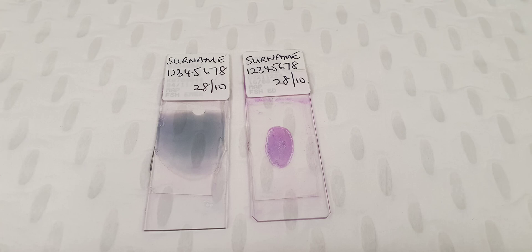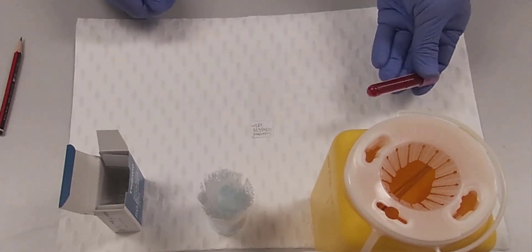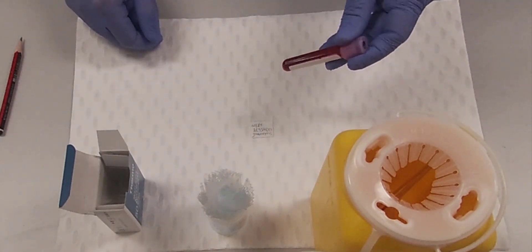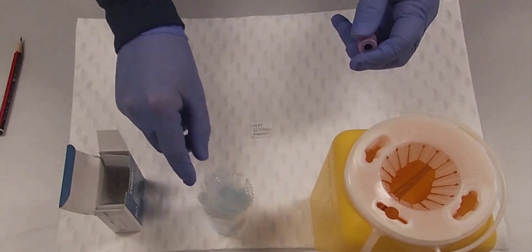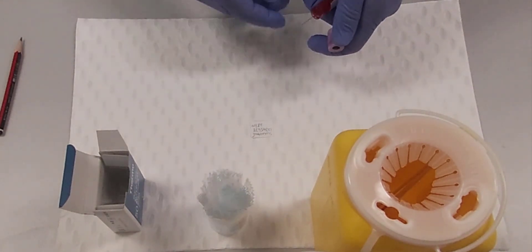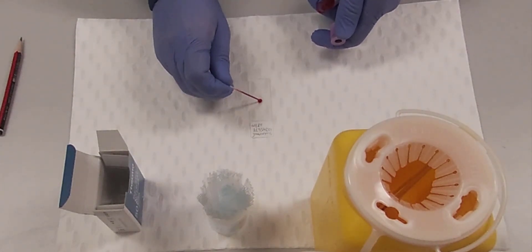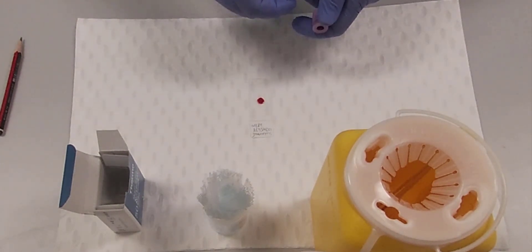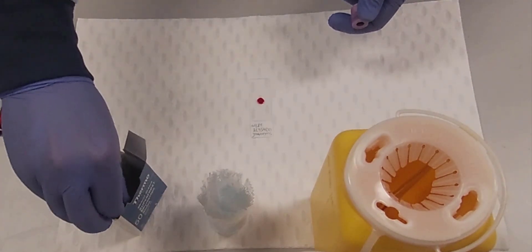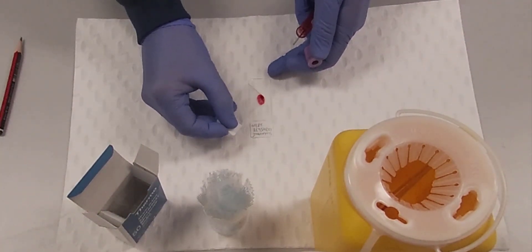Let's look at how the films are made. The thick film is prepared by making a small drop of blood 10 to 15 millimetres across. It is air dried and then stained without fixing.